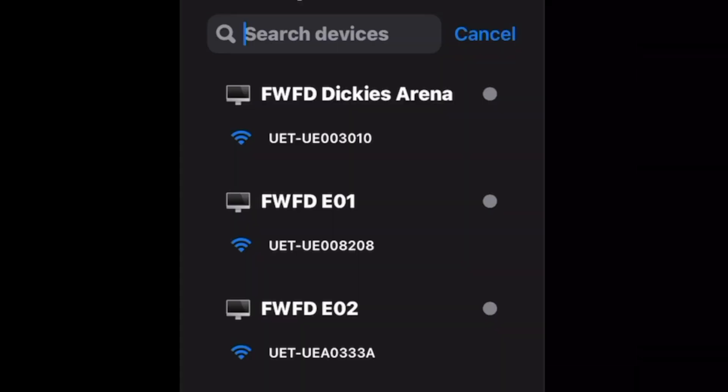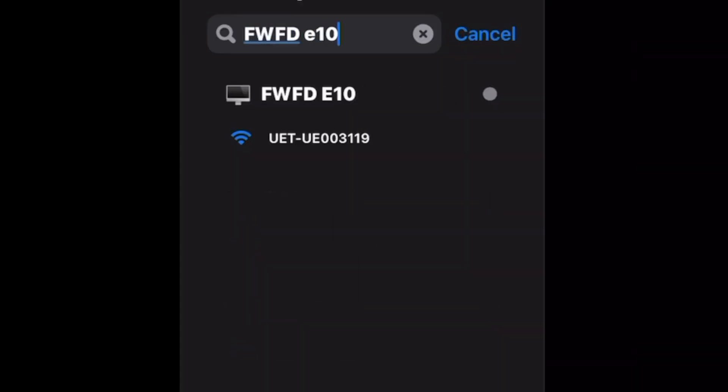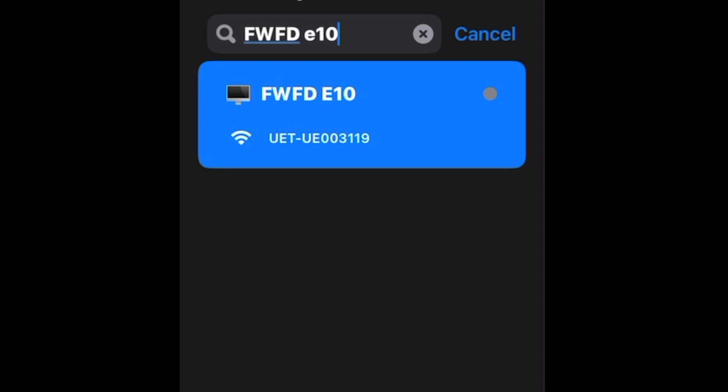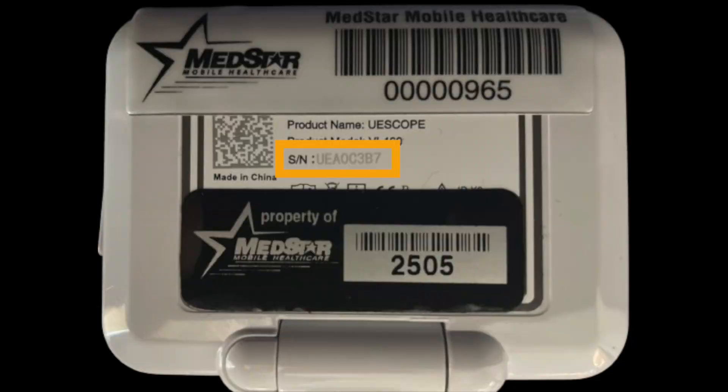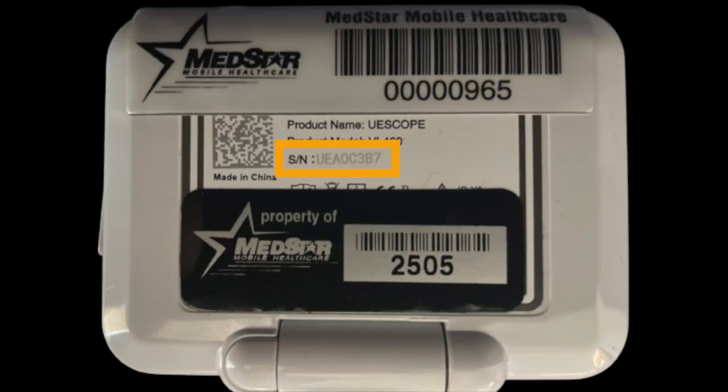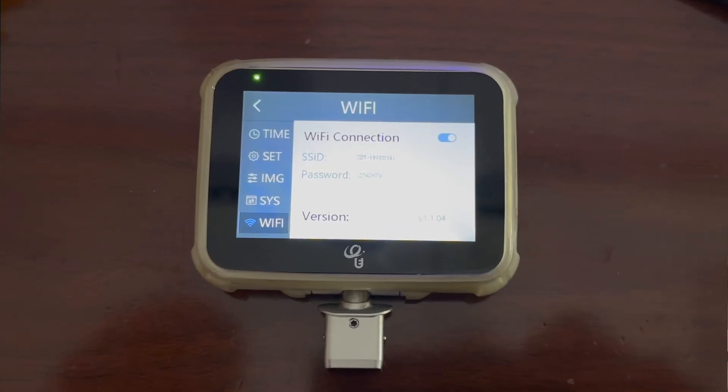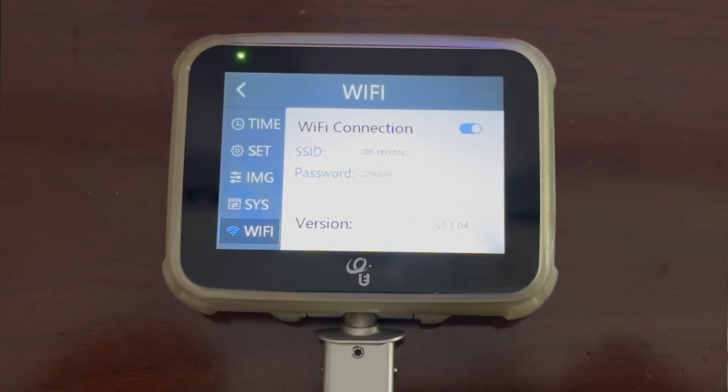If the intubation was performed on an FRO device, you'll search for the Department abbreviation and the Apparatus's call sign. If you're unable to find the device in the list, search by the device's serial number, which you can find on the back of the device and under the Wi-Fi tab in the settings on the UE Scope.